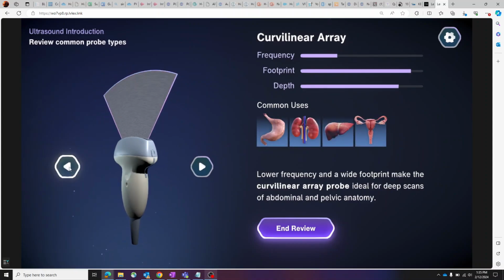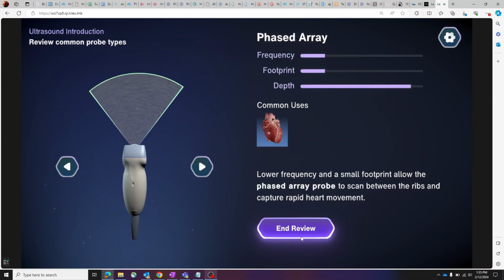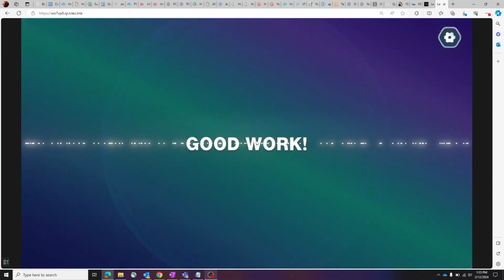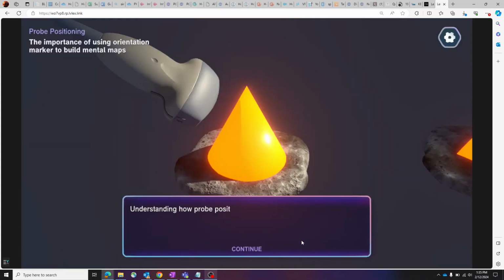Yes. As you evaluate it, what are the metrics for success? Obviously, it's performance. Is it speed, is it accuracy? How do you gauge it? Not yet. That will be part of this. Yeah, that's a great question.